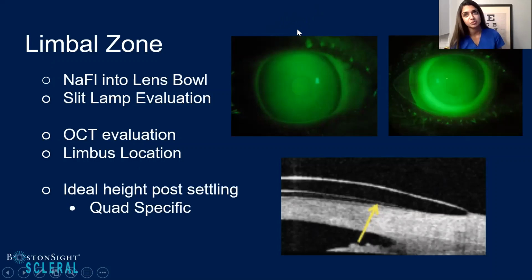It's interesting because with the slit lamp, no matter how high you go on the magnification, it's said that the human eye can only really appreciate about 15 microns of clearance at the limbus. So oftentimes, using an OCT can really give you confidence and trust in yourself as a fitter. And the goal with the limbus is that you want to maintain a nice low profile of corneal clearance at the limbus to make sure you're not doing any harm to those stem cells.